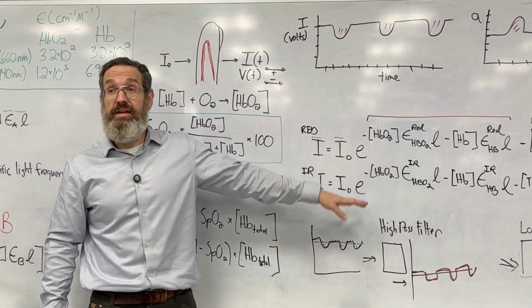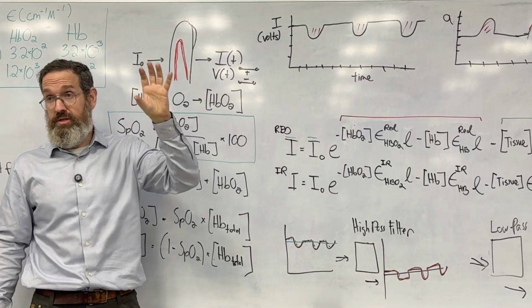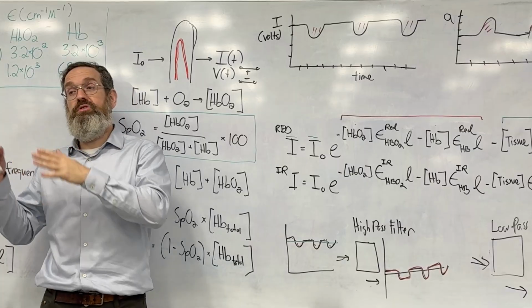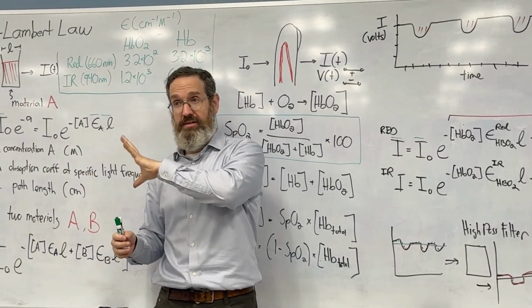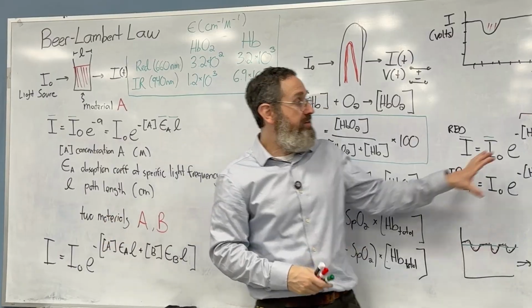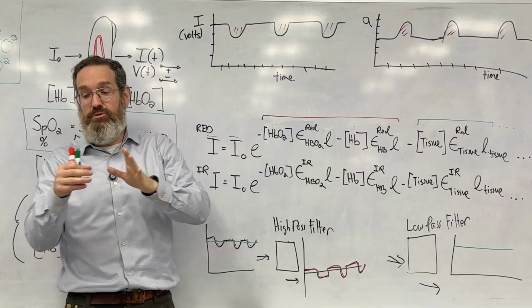So what I'm doing now is ignoring that source of noise. On top of everything I'm showing you today, you will also do that trick. So there's actually two tricks going on. One trick is the flashing light in order to create an amplitude modulated signal. I covered that last time. And now I'm giving you another trick, which is to look at what's changing. And in fact, you would do both tricks at once.